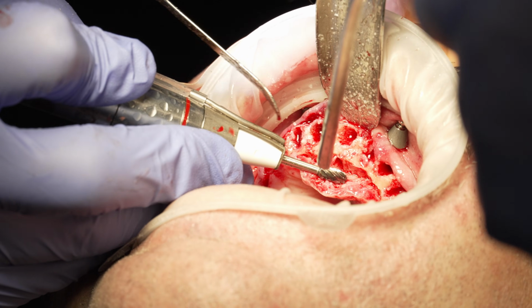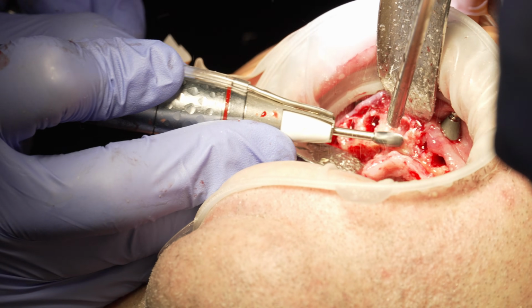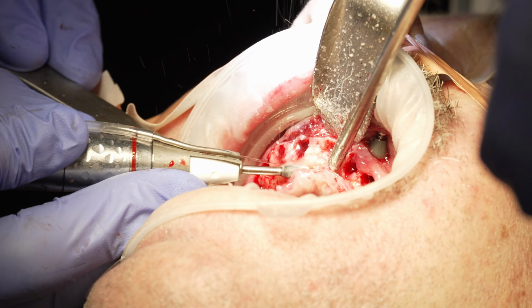Herein lies the biggest issue that we have. Most people don't have that much room even when we take out the teeth. So since we're in the planning stage, we plan to make that room by removing enough bone on the day of the surgery to allow for the thickness of the hybrid dentures.